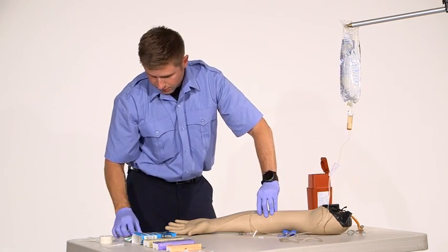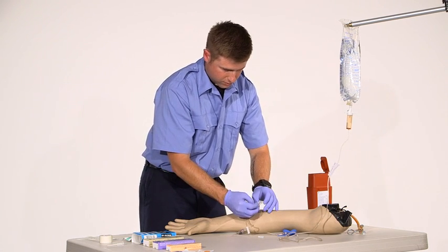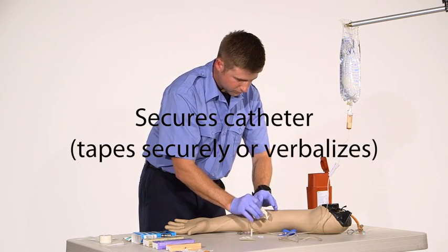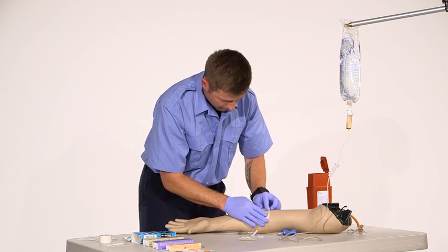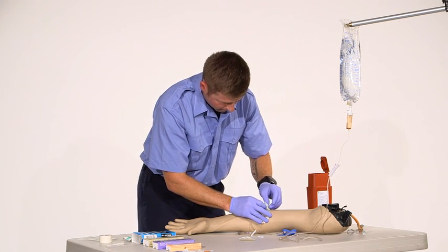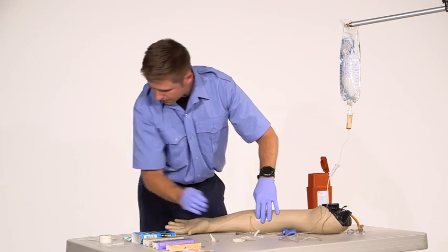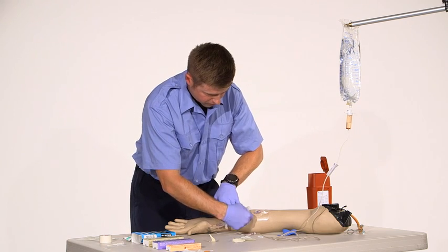And then get my dressing, place this directly over the site. Just tape, secure the line.